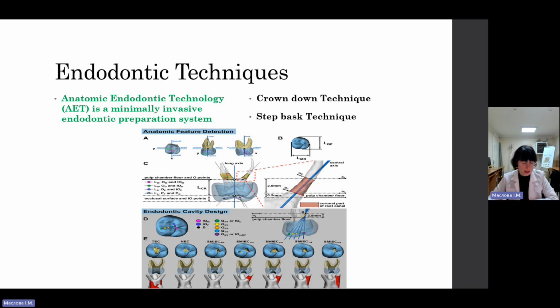In addition, the apical part of the canal is given a moderate taper in an attempt to retain the obturating material within the canal. Furthermore, the canal is flared as much as necessary according to the anatomy of the canal and to facilitate the obturation of the canal. The flare of the canals is especially pronounced with the use of thermoplasticized gutta-percha obturation techniques, which require the insertion of rather large and rigid instruments to the apical region of the canal.